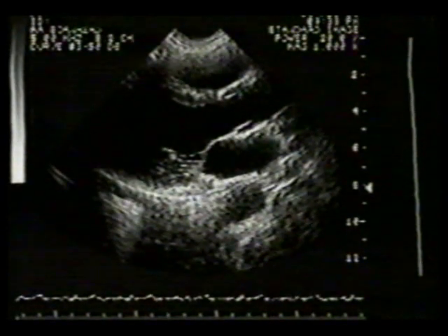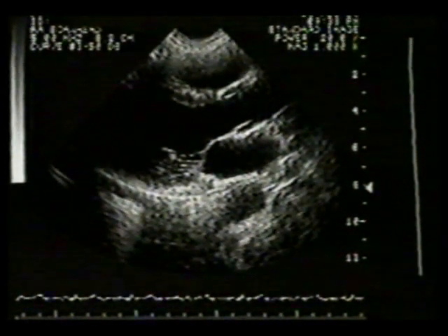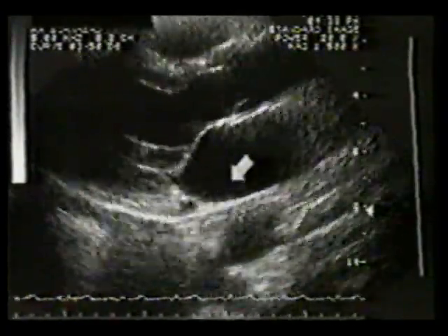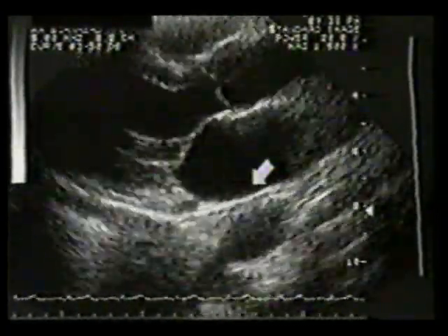We will focus on the coronary sinus using the zoom feature of the instrument, which is ideal for inspecting smaller structures. Note once more the location of the coronary sinus, in the atrioventricular groove, anterior to the descending thoracic aorta, which is also seen in short axis.